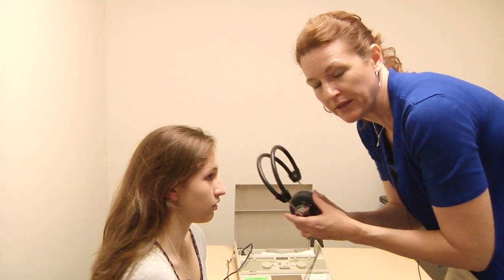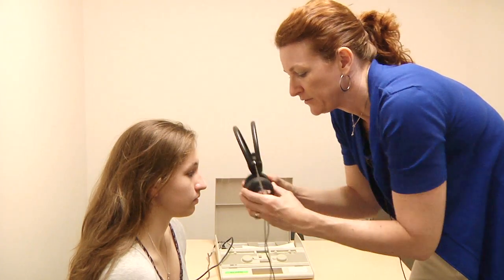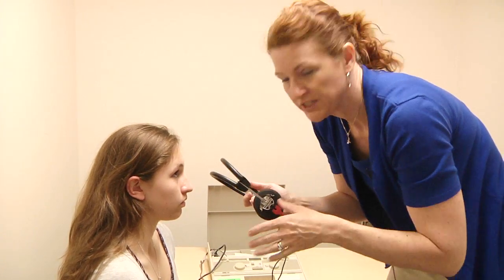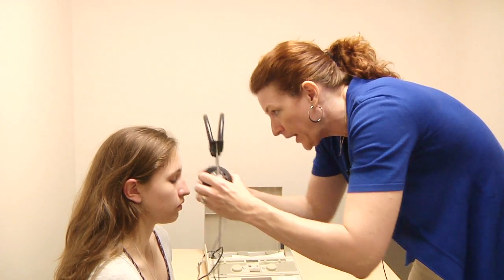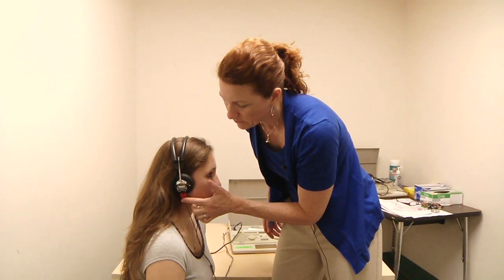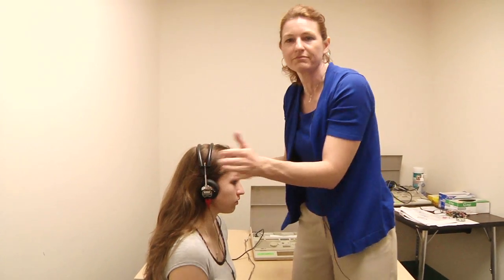But one of the most common mistakes that I see is that the earphones are switched so that instead of the right earphone being placed on the right ear, it's placed over the left. You have to be very, very careful. The red earphone goes over the right ear. I tell my students, recite red, right, whenever you are placing the earphones. You can do it inside your head. And that way you will get the correct earphone placement. If your earphone doesn't happen to be color-coded, if you don't have a red earphone for the right side, just take a little piece of tape and put right on that side and make sure you have the correct placement of the earphones. Now you're ready to go.